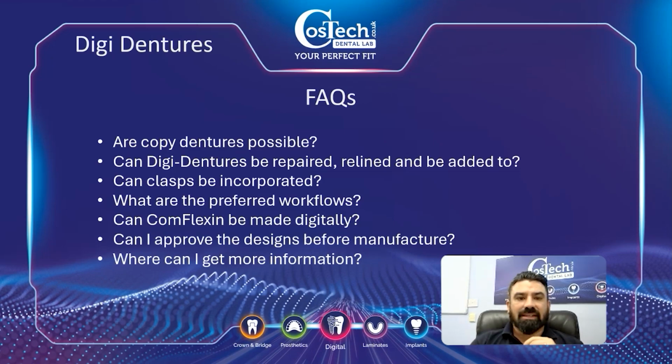Can they be relined? Exactly the same way. And can they be added to? Yes. When we add to them, we do use just the stock teeth that we have.